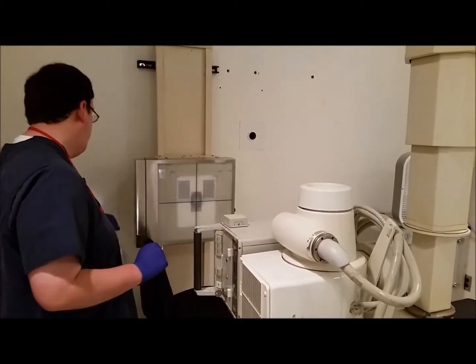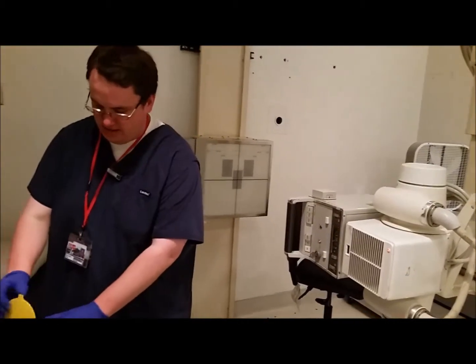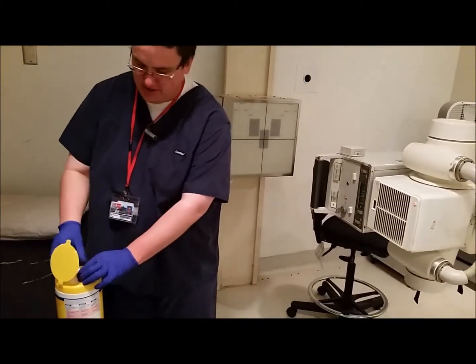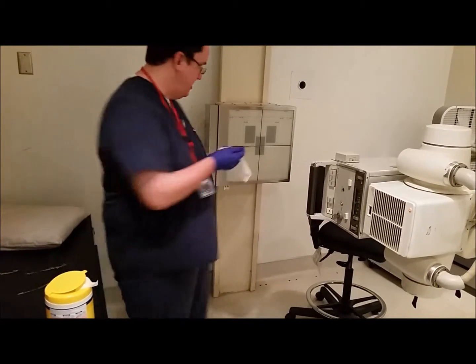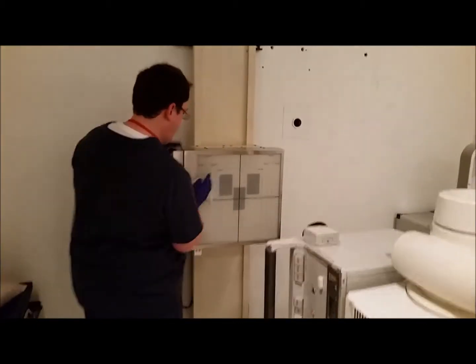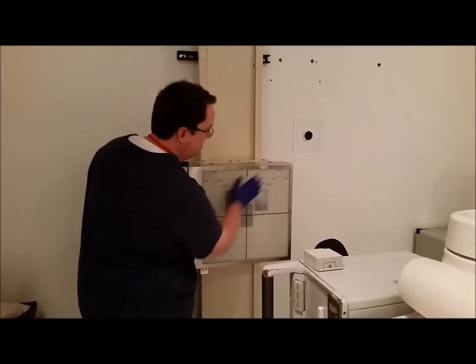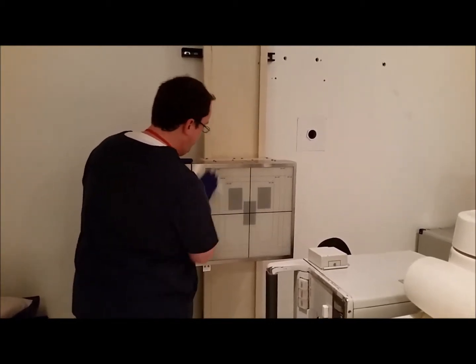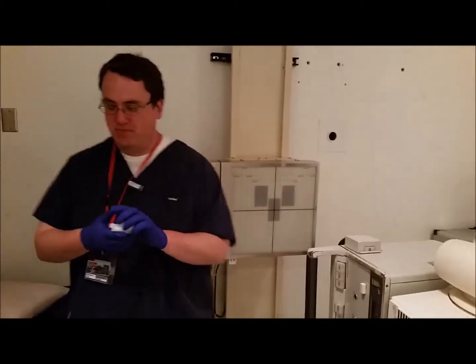Alrighty, looks good. Alright, and last step, we want to make sure that the Bucky is nice and clean for our patient. A lot of germs and stuff could be on there from people coughing and all that sort of thing. So we'll give it a good wipe down. No one wants to put their face on a dirty Bucky like this. Alright. Let the air off a bit while we bring in our patient in here and everything. We'll be ready to go.